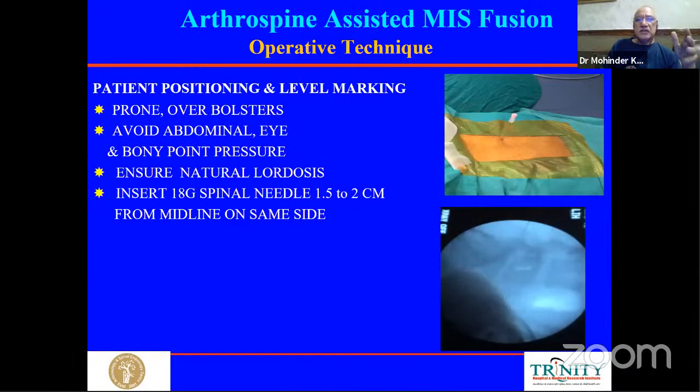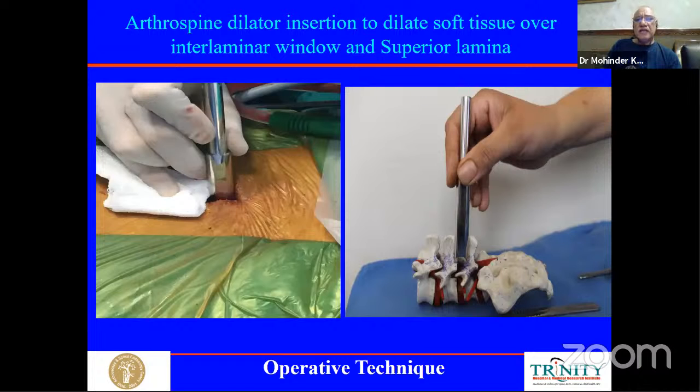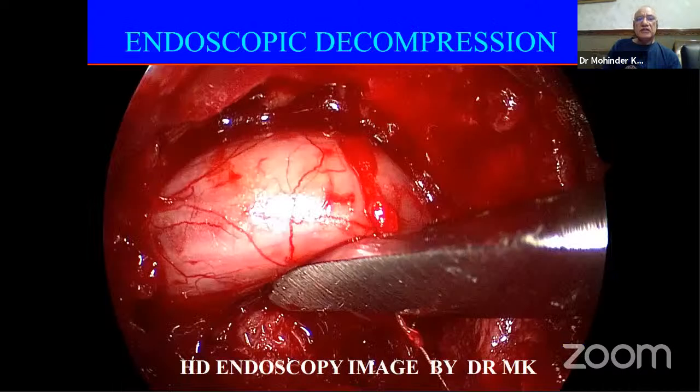And this is just to share with you a patient with spinal instability and lumbar canal stenosis. The first step is level marking. When I am planning a fusion, I keep an incision of about 15 to 20 millimeter, but for standard canal decompression and disc surgery, it is around 10 millimeter only. Then the same dilator and then sliding of the tube. The first step is to have an adequate neural decompression. That is the first prerequisite.